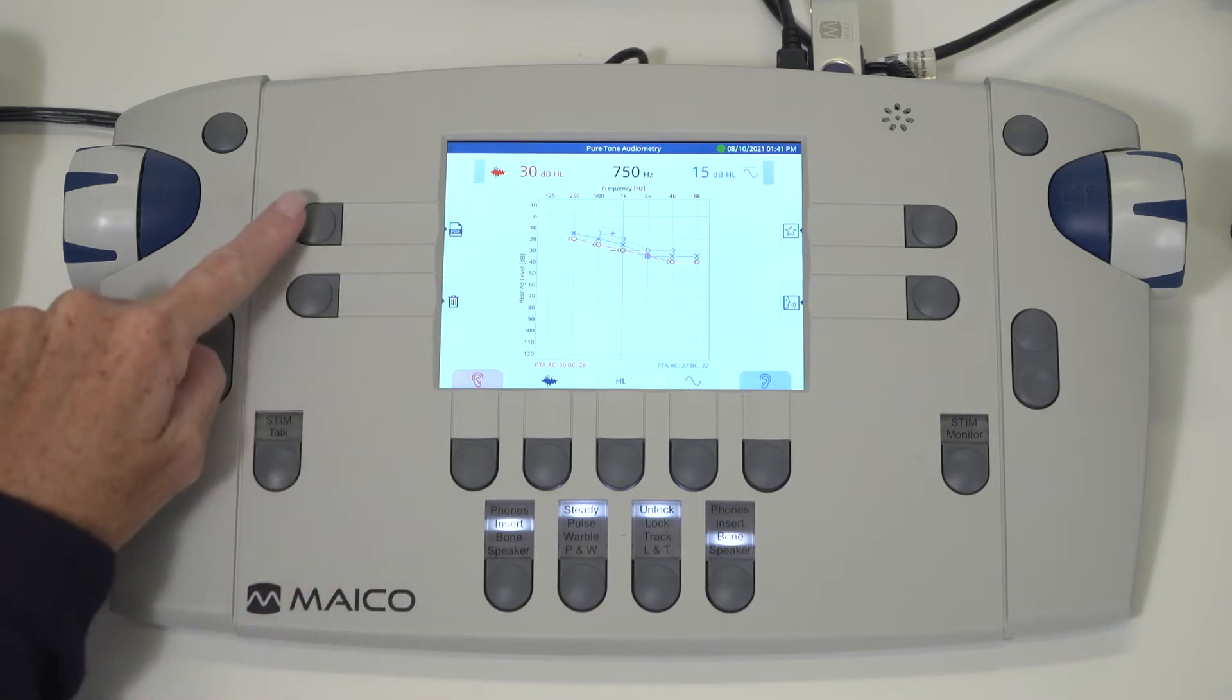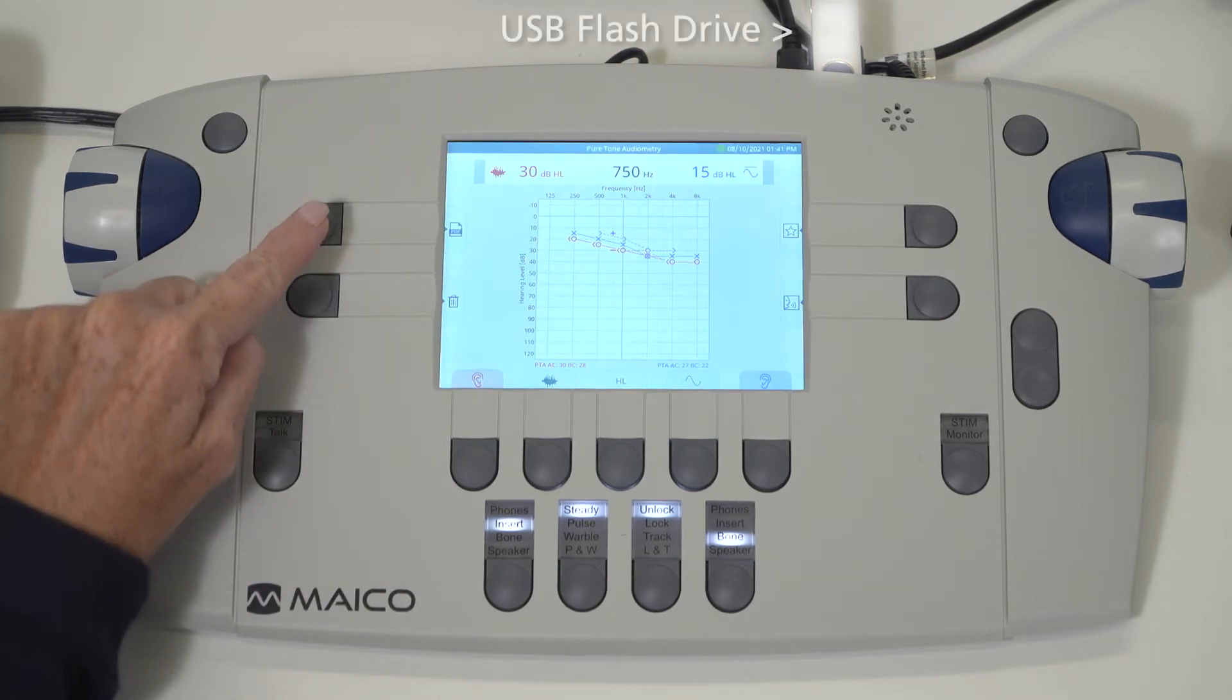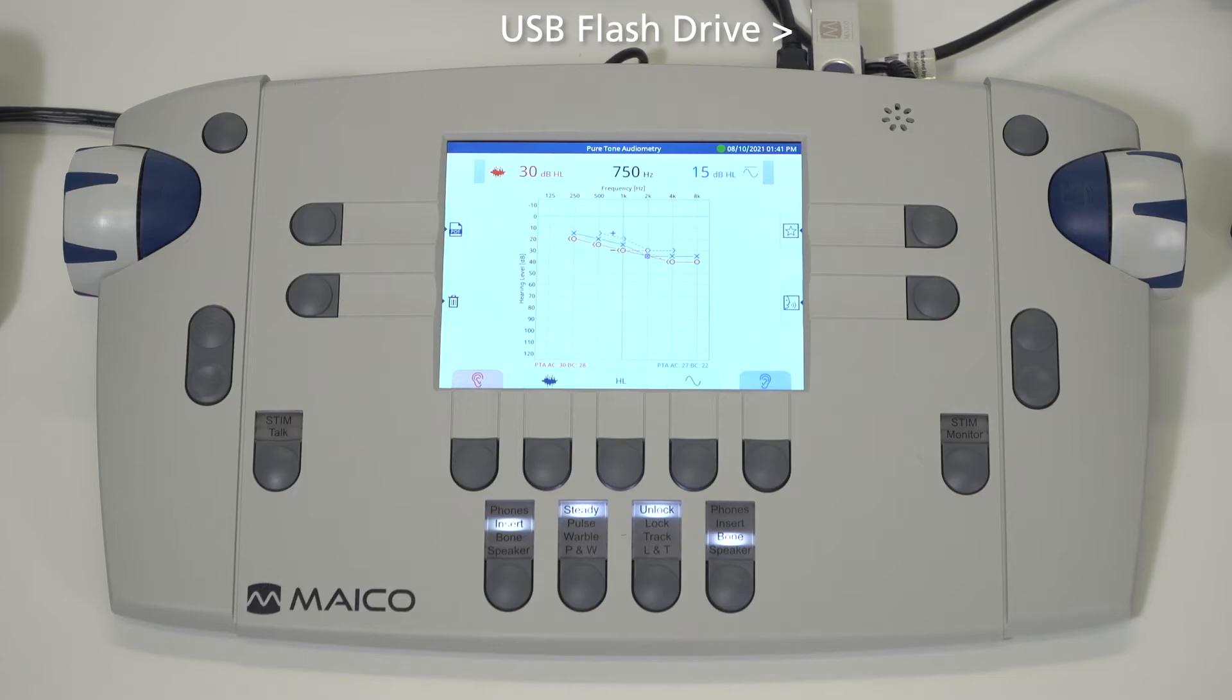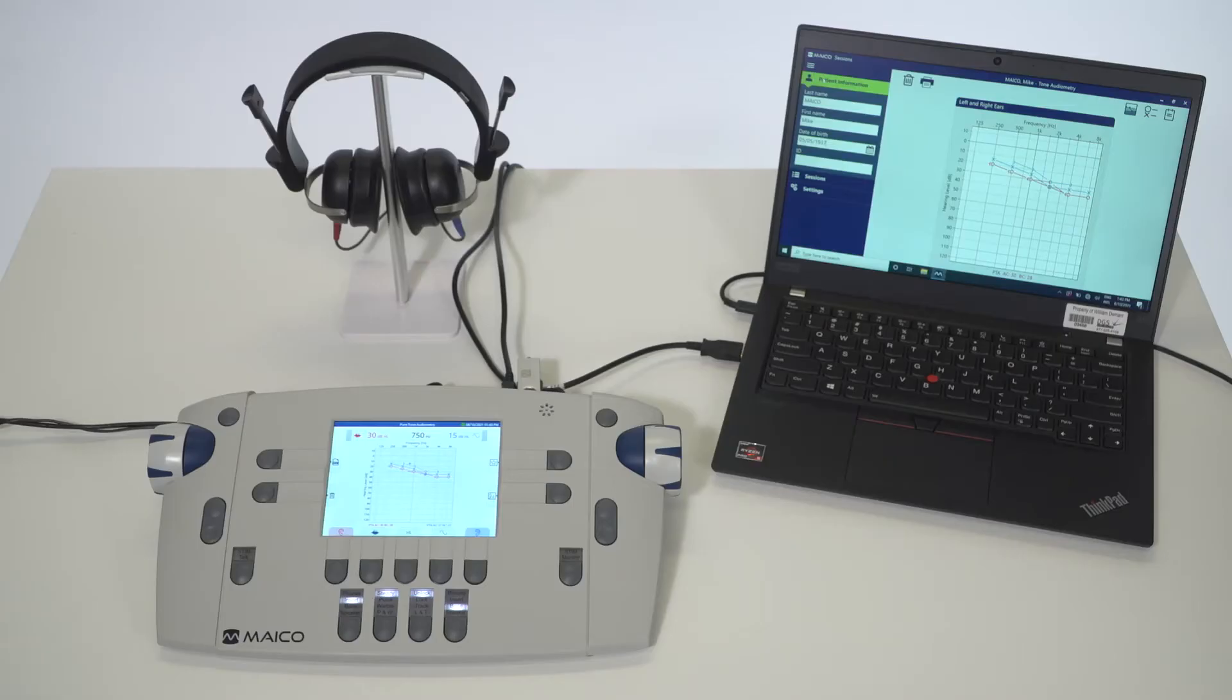Pressing PDF will save the results to a USB flash drive connected to the USB out socket. The USB flash drive can then be plugged into a computer and reports can be saved or printed.